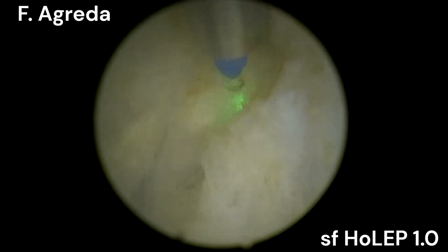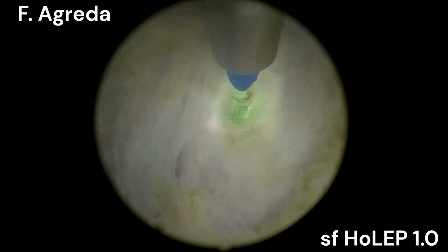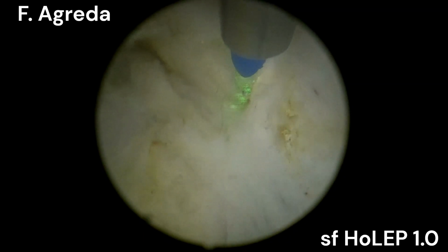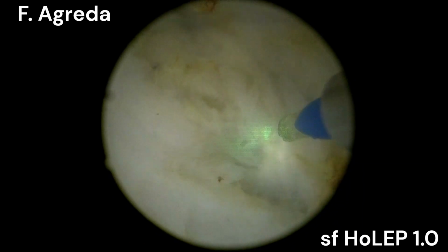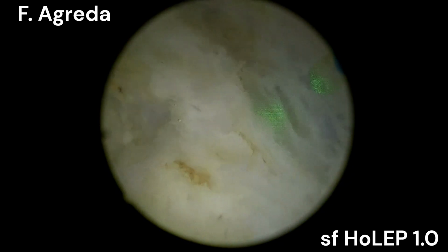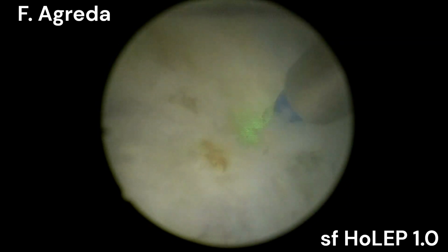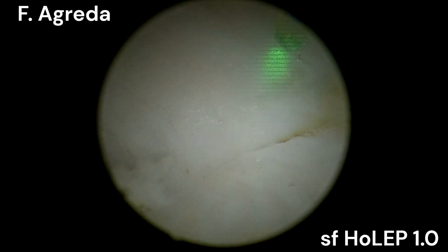Now we continue the progress of the enucleation always through the anterior aspect of the capsule and the anterior aspect of the adenoma. We do a semicircular dissection from 3 o'clock to 9 o'clock and vice versa till we reach the bladder neck fibers and the bladder, so we have that reference, and then we progress to do the bladder neck dissection, and then the last part is to do the verumontanum anterograde dissection and to free the adenoma as a whole block.